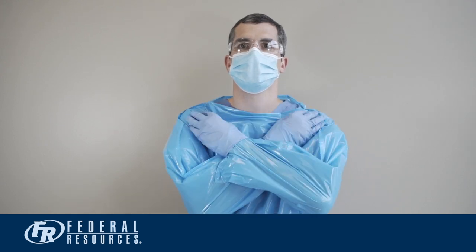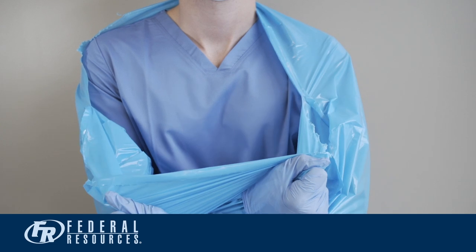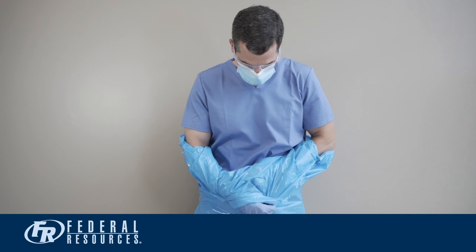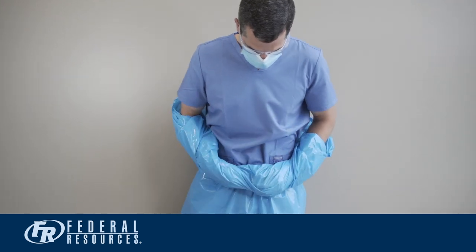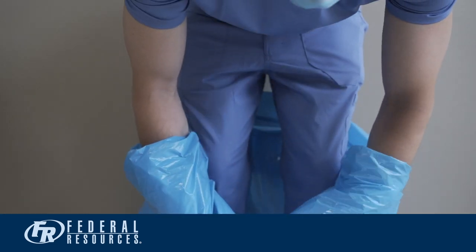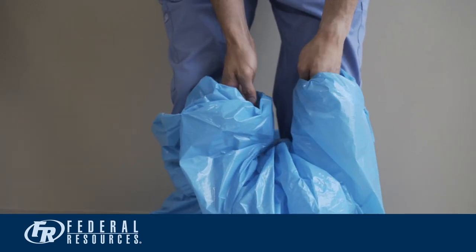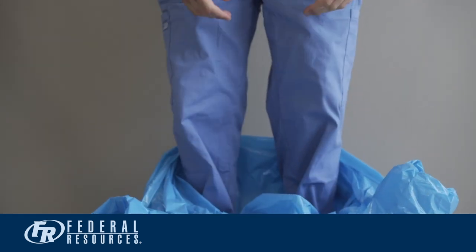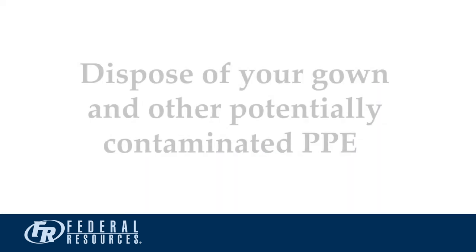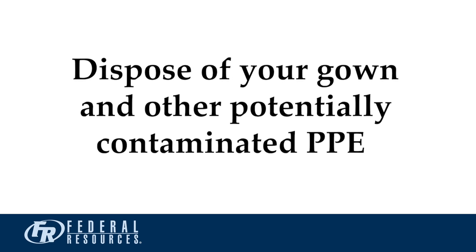To remove your gown, first give yourself a hug. Grab your gown at the shoulders and pull the gown forward from the shoulder area. Keep your hands inside the sleeves while you roll the gown away from your body, down toward the gloves. Remove the gown and the gloves together as an entity, allowing both to drop towards the floor. While only touching the clean inside of the gown, push the gown down all the way past your feet. Carefully step out of the gown. Dispose of the gown and other potentially contaminated PPE according to medical waste procedures.